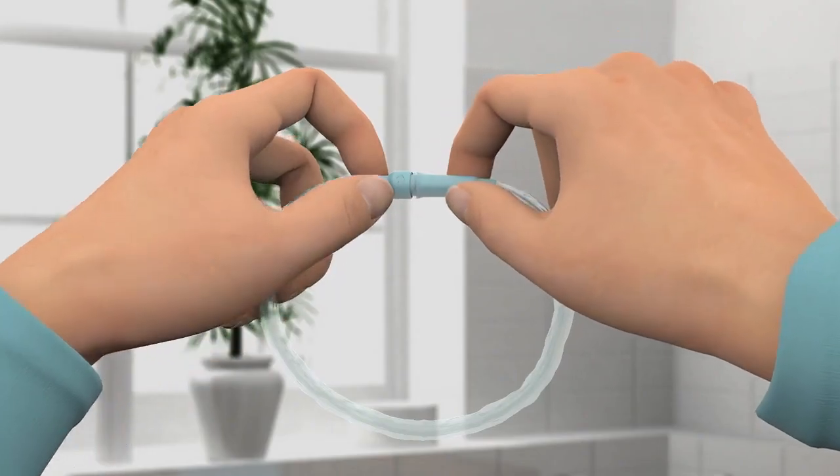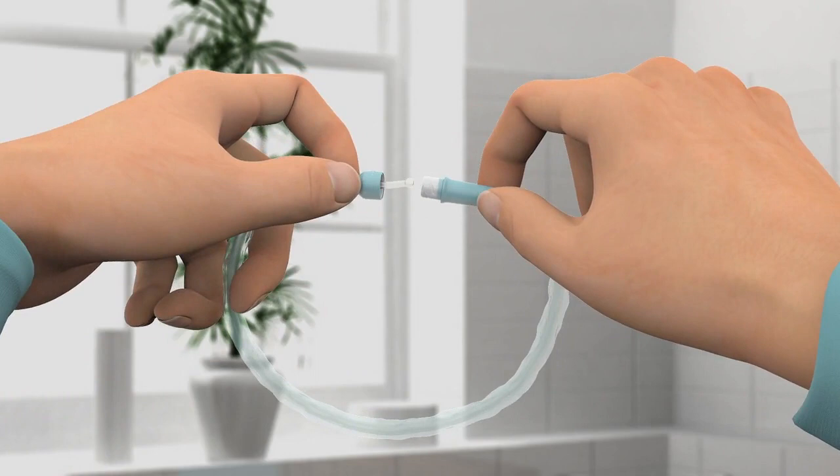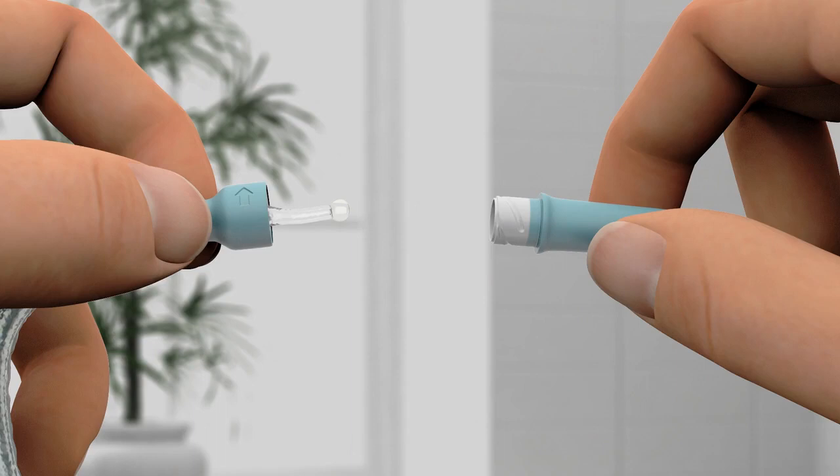Take the catheter out of the packaging and twist the lock to open. Make sure to hold both ends of the catheter upwards to avoid spillage of the liquid inside the sleeve that covers the catheter. If you use a urine bag, you can simply connect the catheter to the urine bag to drain it. Make sure that the catheter tip does not touch anything before you enter it into the urethra. If it does, you must use a new catheter. Touching the sink or your clothes or skin, for example, will contaminate the catheter and can potentially cause infection.